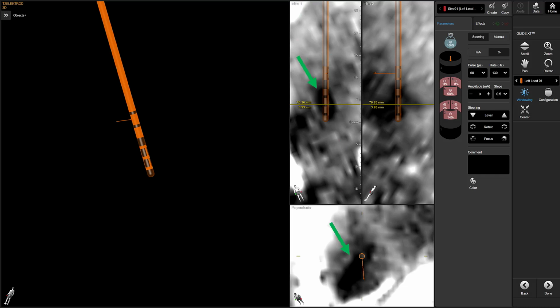At a recent meeting, a well-known neurologist said that with visual programming we can for the first time see the STN and where the electrode is placed. What she probably meant was that with visual programming it is easier to perceive the STN when the navigation system is analyzing the MRI images and is drawing a borderline around what it interprets as the STN and then fills this structure with a shiny color.